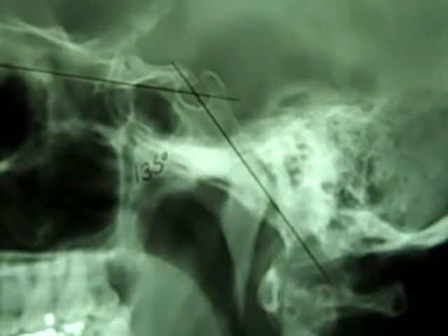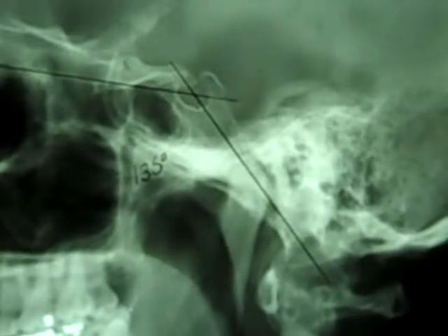moving on, the next one is called McGregor's line. And McGregor's line is going to use the superior posterior aspect of the hard palate. I'm going to move the camera just a little bit.